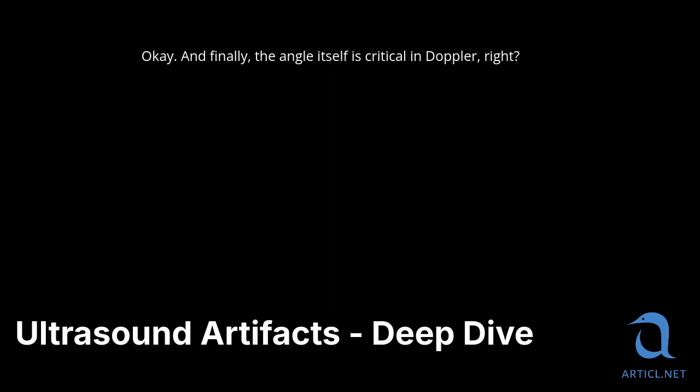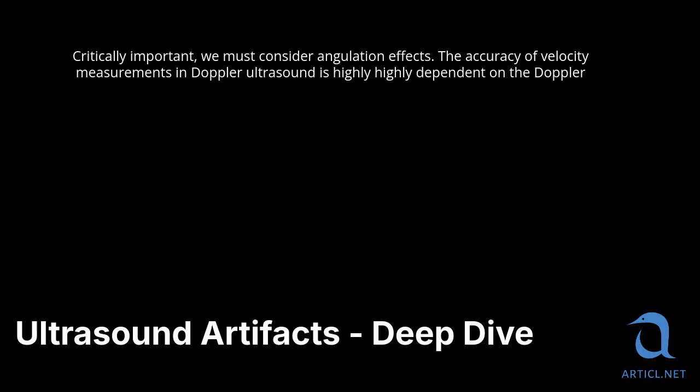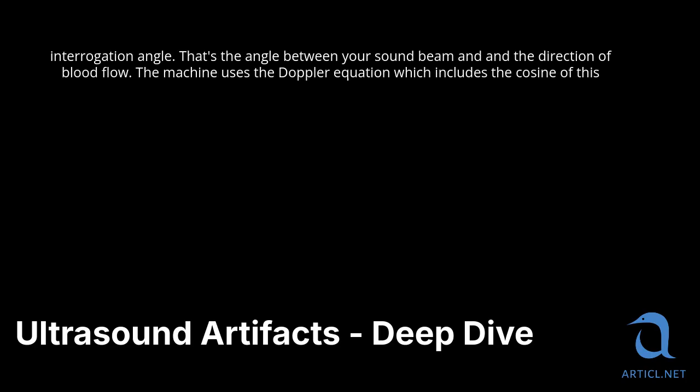Okay. And finally, the angle itself is critical in Doppler, right? Critically important. We must consider angulation effects. The accuracy of velocity measurements in Doppler ultrasound is highly dependent on the Doppler interrogation angle.